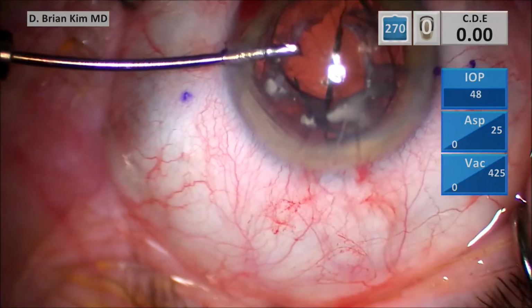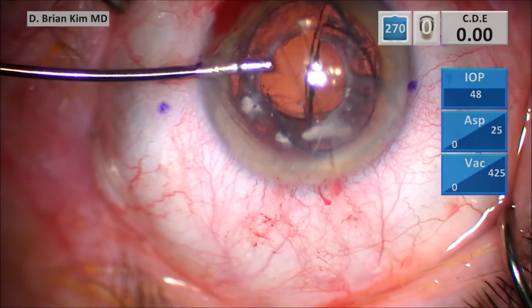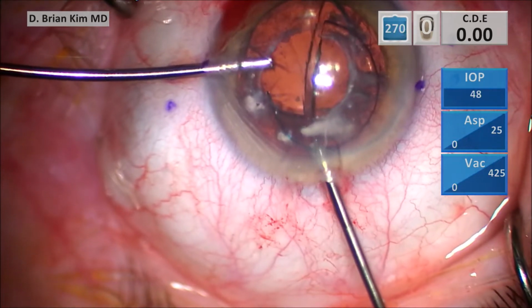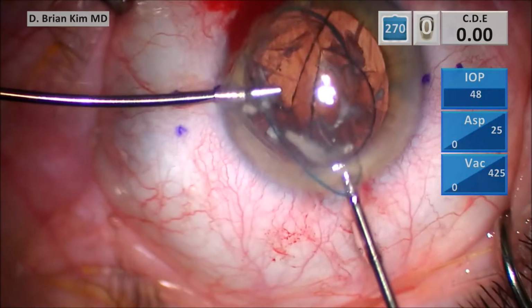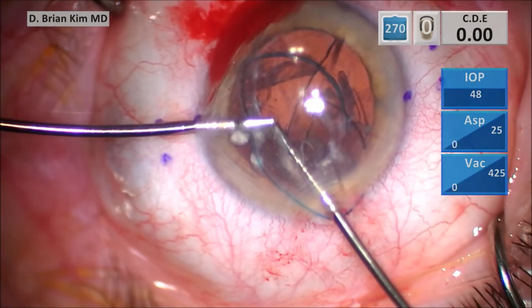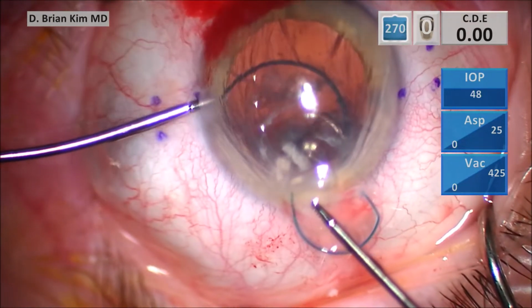And while I'm holding the left half, still with the micro forceps, I'm going to then use another set of micro forceps to grab that trailing haptic. Very carefully, I'm handshaking it to the tip, pulling the tip of the haptic out, and then grasping the edge of that optic, and then pulling it out. But then with the forceps in my left hand, I'm grabbing the other haptic just to make sure it doesn't want to fall as I do this.